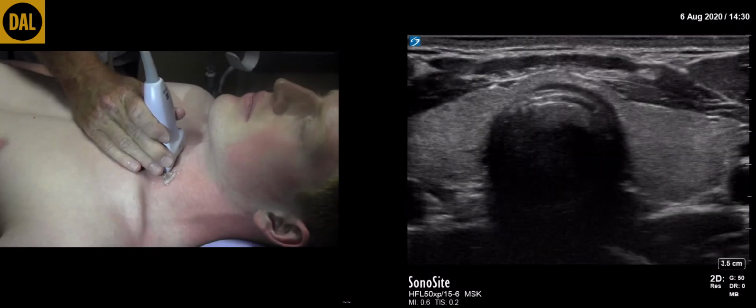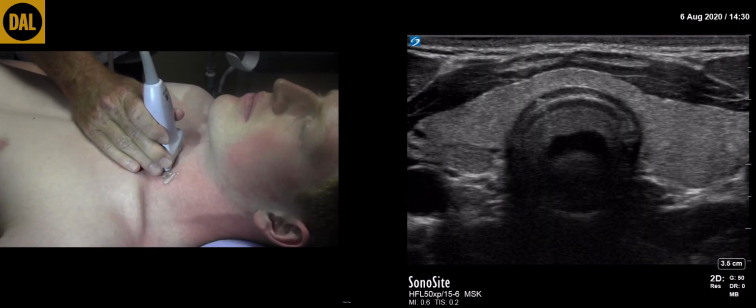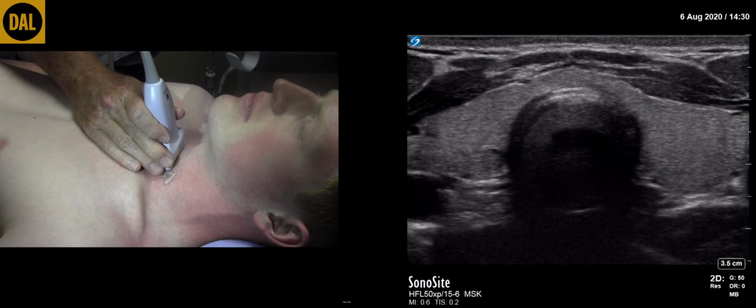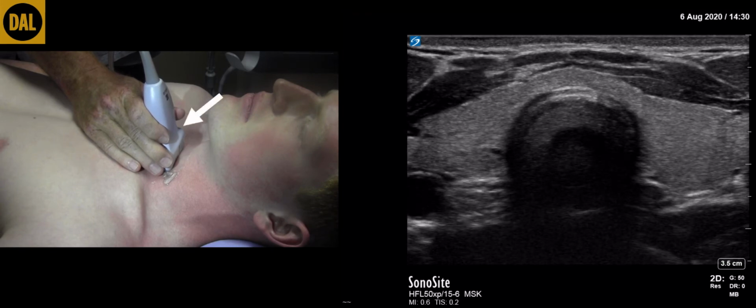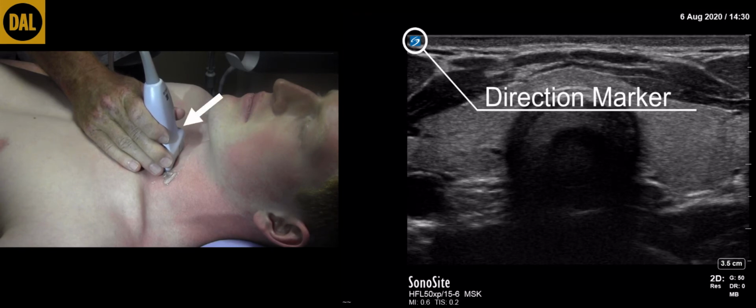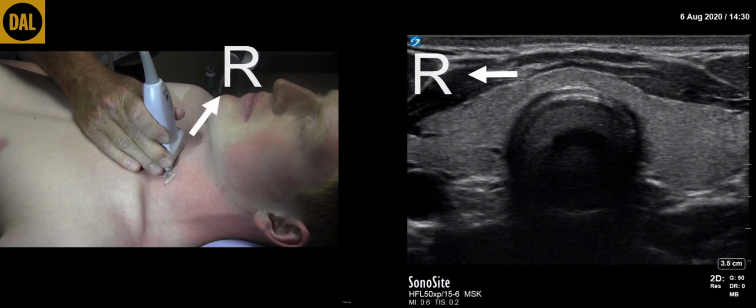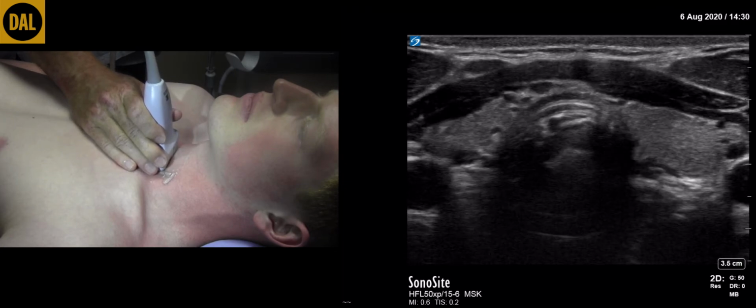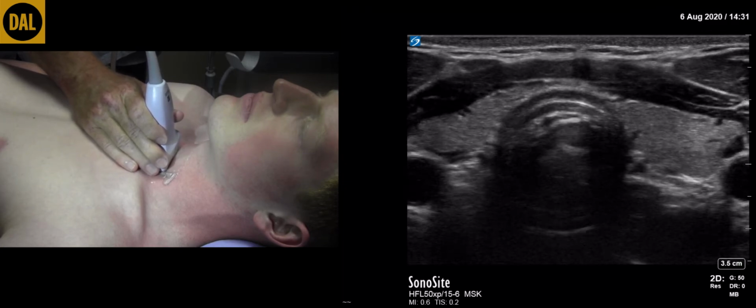Okay, so now we're ready to start scanning. The depth should be set initially to somewhere between 3 and 5 centimeters. This can be adjusted later to optimize the image. The transducer is in the transverse plane. The direction marker on the transducer corresponds with that on the screen and indicates a patient right direction. Slide the transducer cranially and caudally until the thyroid gland is visualized.